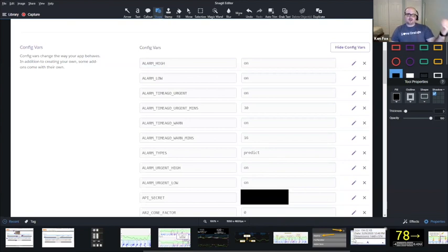If you're gonna cross 70 or 55 within 15 minutes, based on the speed of the change, it will trigger a Nightscout alarm as well. Like you're not low yet, but it's letting you know that you could be or will be low or even predicted high. You can have that one on as well. So the predict one's pretty cool.